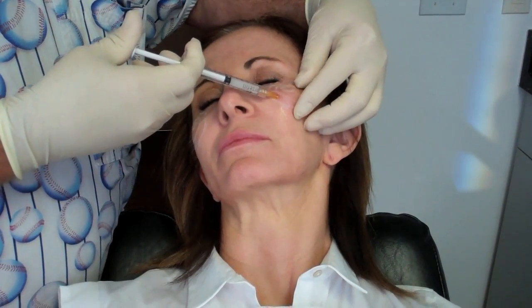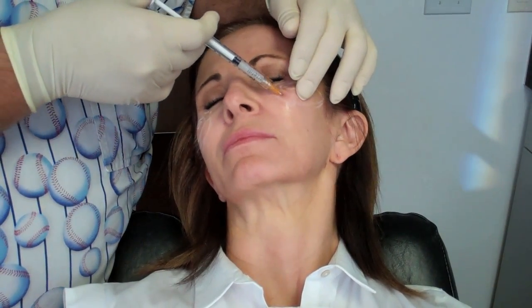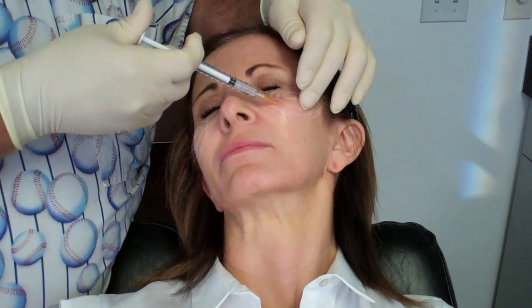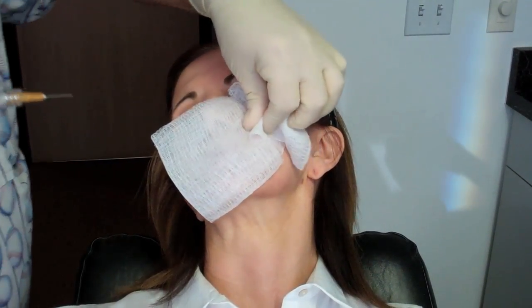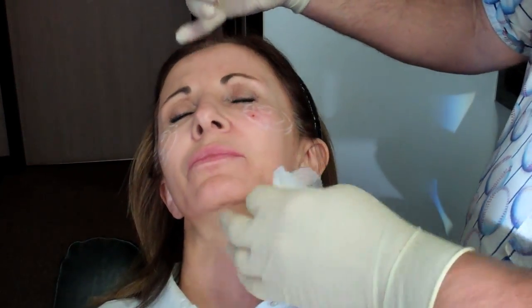We're good — going to 0.3, 0.4, 0.5 — you can see it's bigger already. Now I'm going to come back over here and fan in the same way, but to put some into the nasojugal groove. That was 0.1.